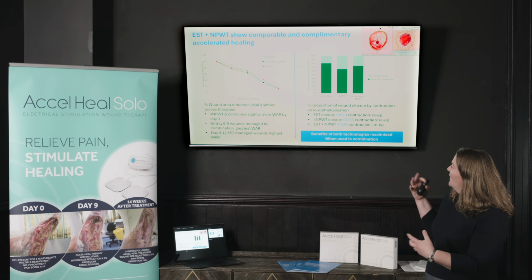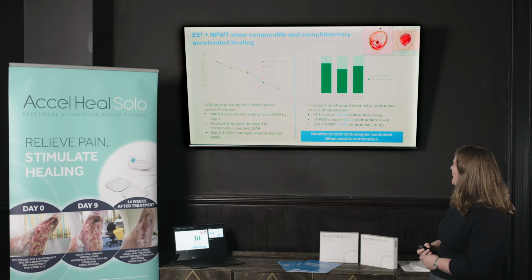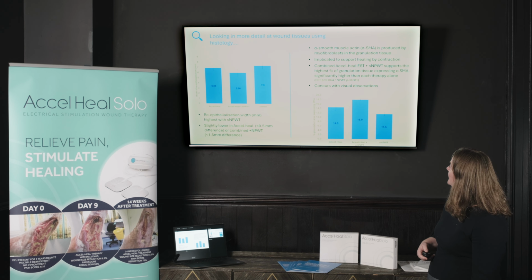So obviously, combining the two, you can see here, optimises both angles of wound healing, which is great. And again, it really fits with the clinical application in terms of understanding the mode of action. We can then understand which piece fits in that jigsaw. So the benefits of both technologies were basically maximised when we used them in combination.